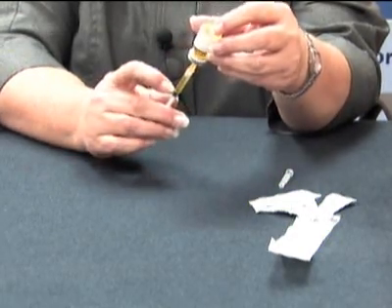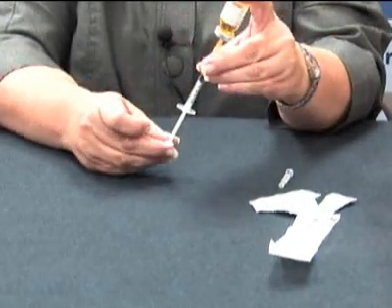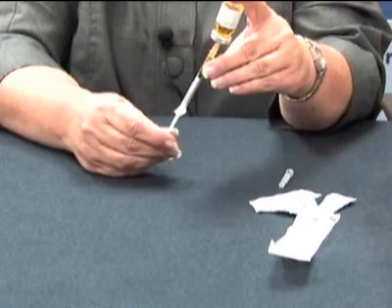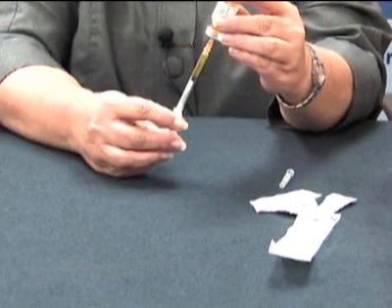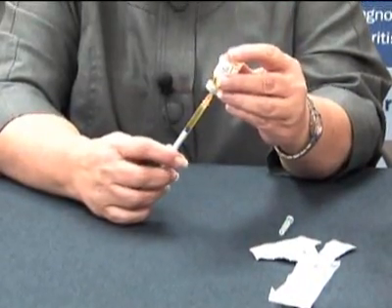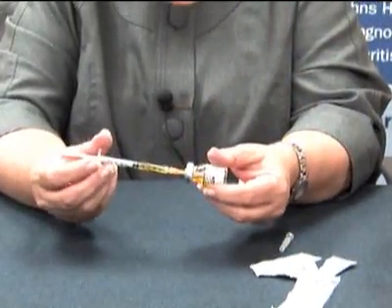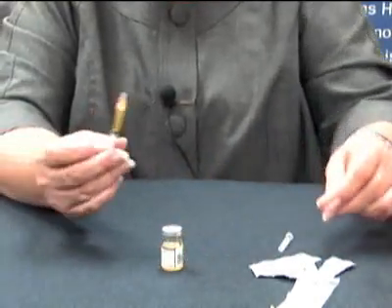Should I have an air bubble inside the syringe, I can just push the plunger back up to release that air bubble and then pull back down again. Once I have the correct amount of fluid in the syringe, I can set that aside.